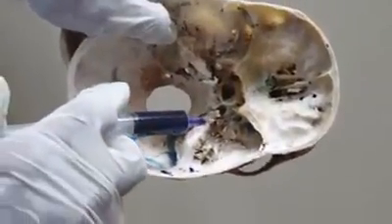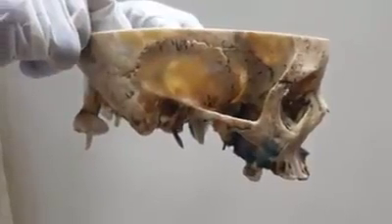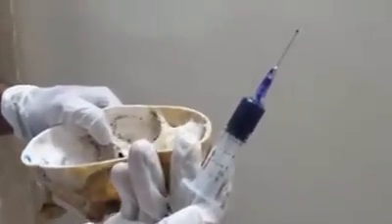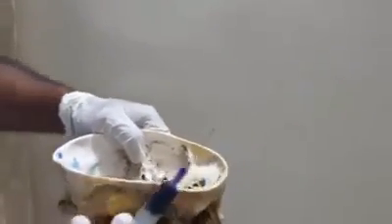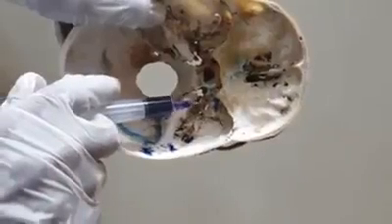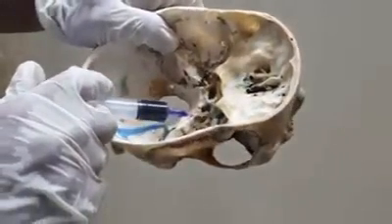The maxillary nerve travels through the foramen rotundum and gives a branch to the pterygopalatine ganglion, or the sphenopalatine ganglion. This foramen rotundum is very near to the pterygopalatine fossa. So when you are injecting a drug, you should be very careful about the volume. If you inject more than 3 ml of drug, then there is a high possibility that the drug can enter the middle cranial fossa also. In this video, I am showing how the dye, when injected into the foramen rotundum, comes out through the pterygopalatine fossa.